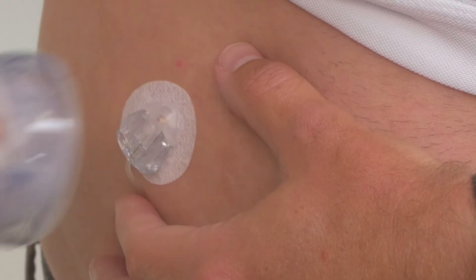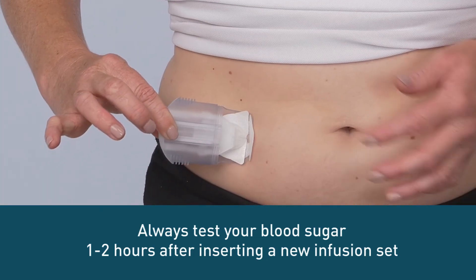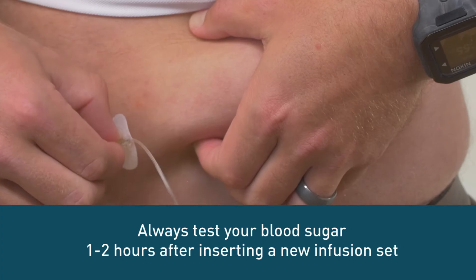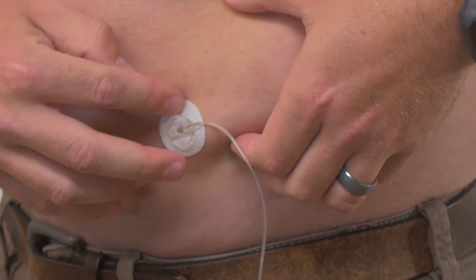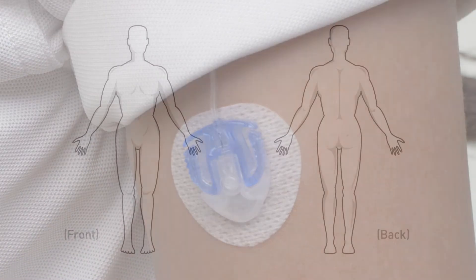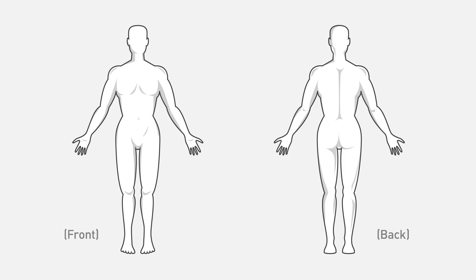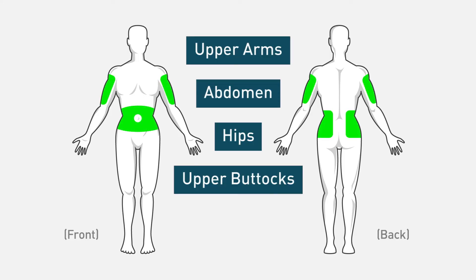Different people find different sites absorb insulin differently, so it's a good idea to watch your blood sugar closely after you change sites. It's also important to rotate your site placement, as infusing insulin into the same area can change the way that tissue absorbs insulin over time. Most commonly recommended sites are the upper arms, abdomen, hips, upper buttocks, and thighs.